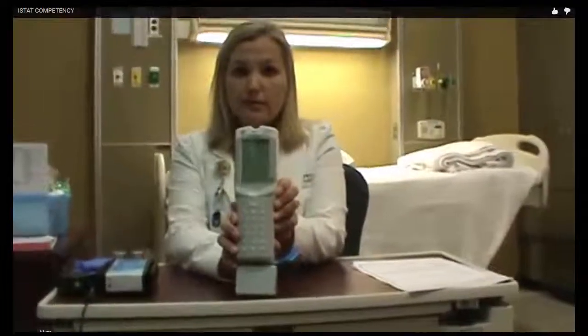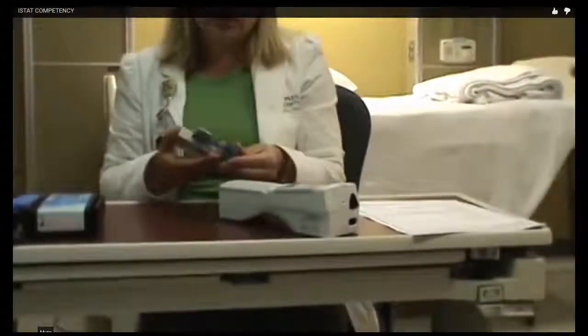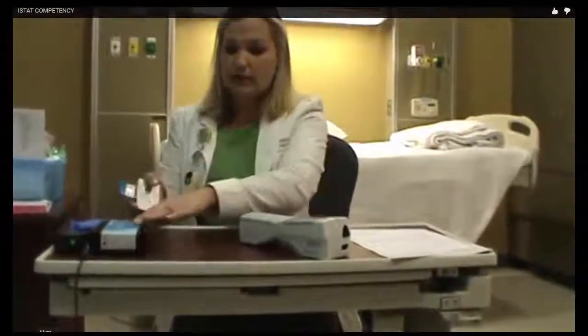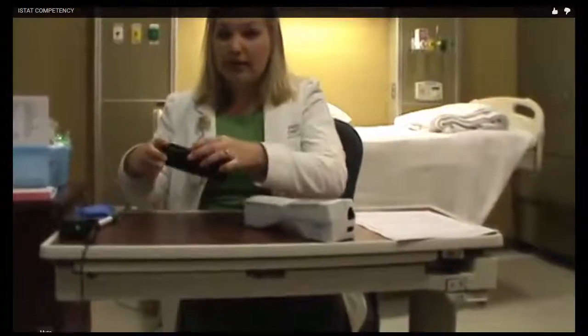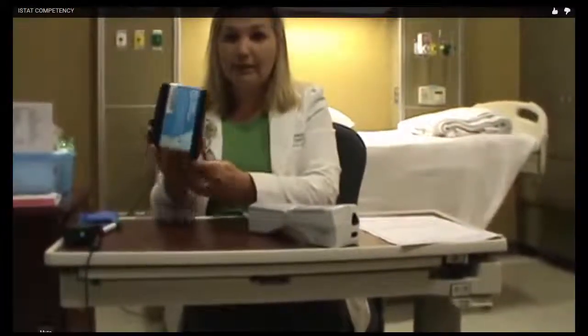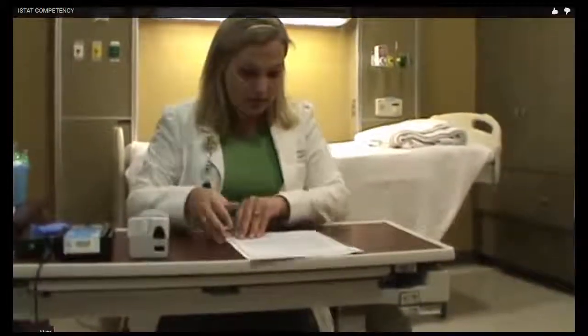Our simulator passed, and it says so. So we'll just take that out, make sure you recover the contacts, put it back in the box, and back in the drawer in the lab where you found it. We only have one, and we have to have it. We'll get back to this in just a sec.